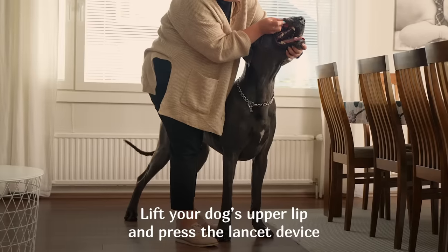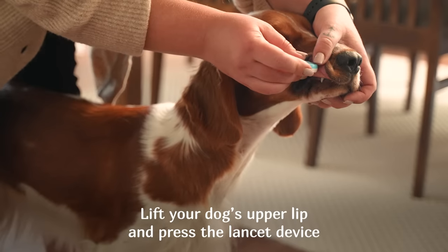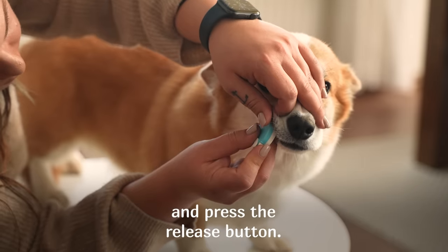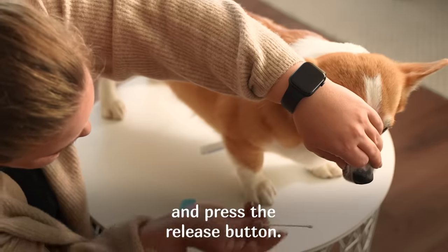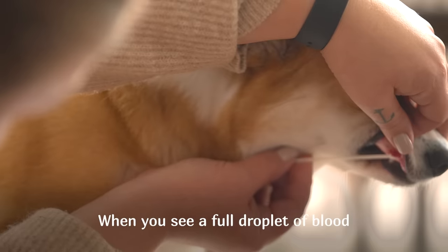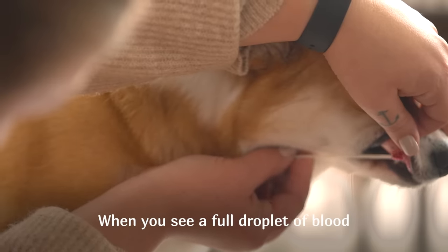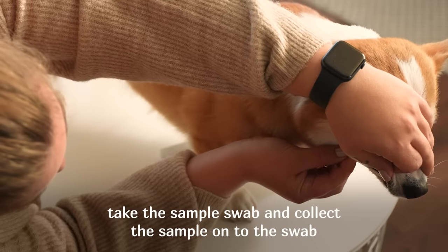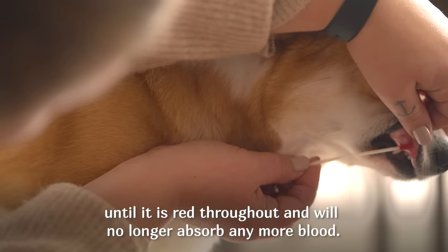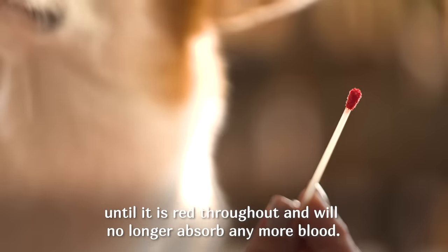Lift your dog's upper lip and press the lancet device firmly against the dog's inner lip horizontally, then press the release button. When you see a full droplet of blood, take the sample swab and collect the sample onto the swab until it is red throughout and will no longer absorb any more blood.